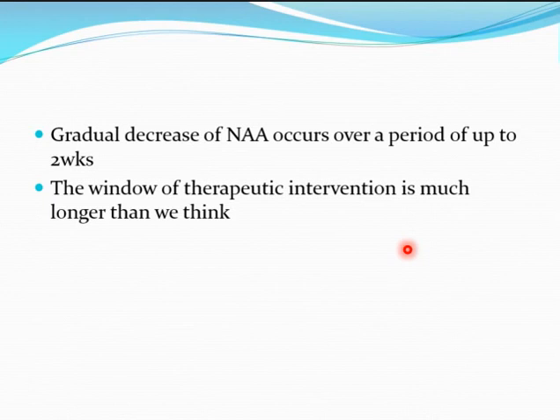So this is still under research till now, but it indicates that we can treat for a much longer period than we thought previously. The brain heals itself over a longer time, which gives you a lot of time to treat, not like we thought previously, within a few hours and that's it, the brain is dead and we can do nothing about it. This is one of the major research advantages of MR spectroscopy.